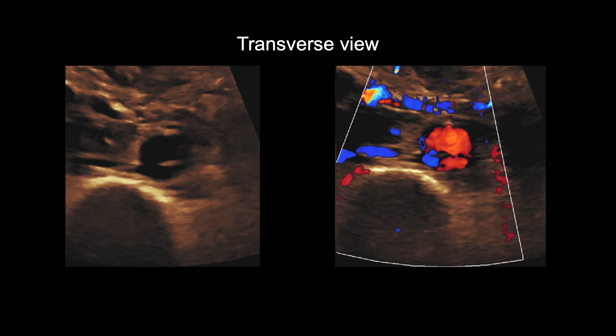Here is another example of a dissection in transverse view. Dissections appear as a bright line on black and white ultrasound images, but when color is added, they appear as a linear color void.